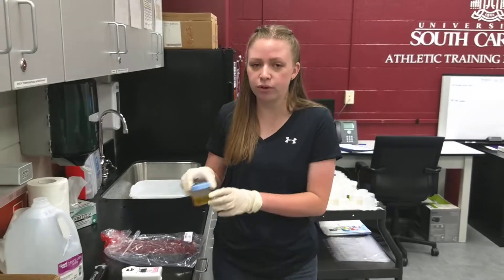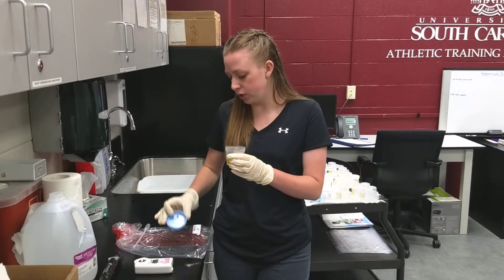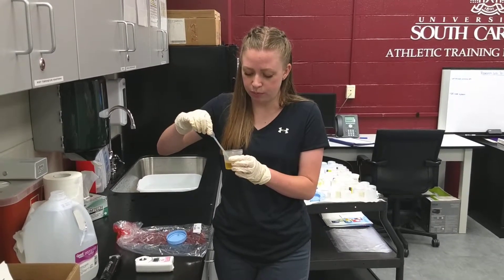First you'll have the patient provide a urine sample, then while wearing gloves you'll take a pipette and get a few drops of the sample.